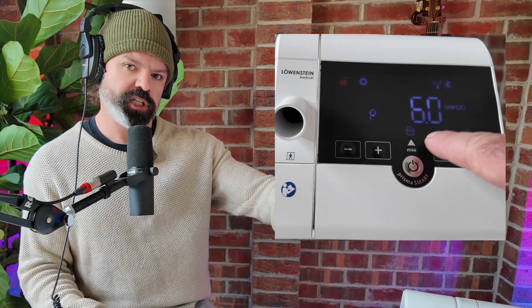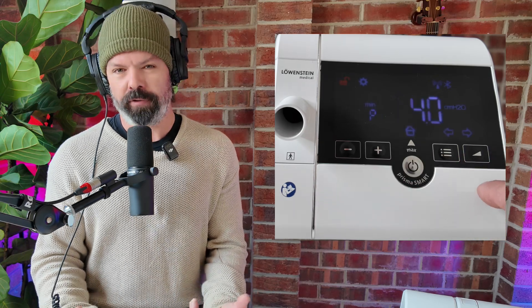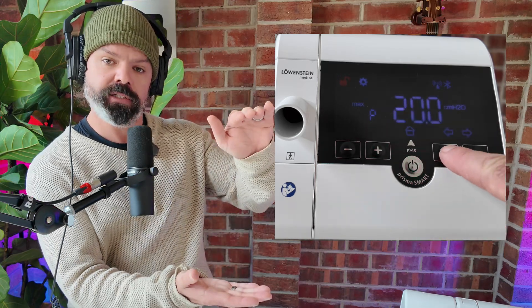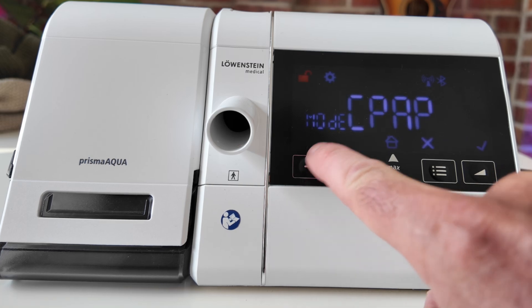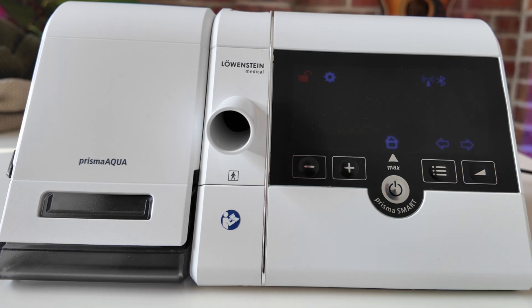So if you select CPAP mode, you'll just set a single pressure. However, if you choose APAP mode, you'll get other options for things like minimum and maximum pressures, giving the device a pressure range to work within. Let's go ahead and lock in APAP mode to start with, since that's what most people use when starting out. Press the ramp button to lock in APAP mode.